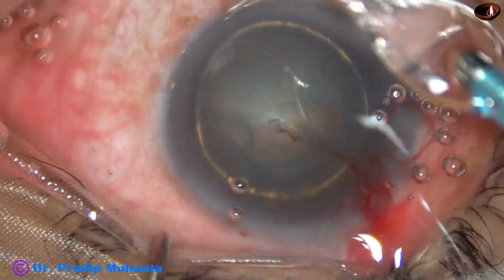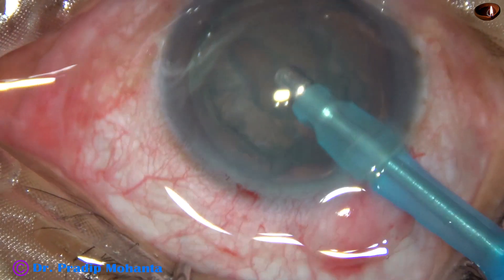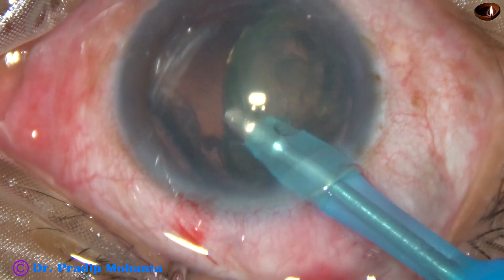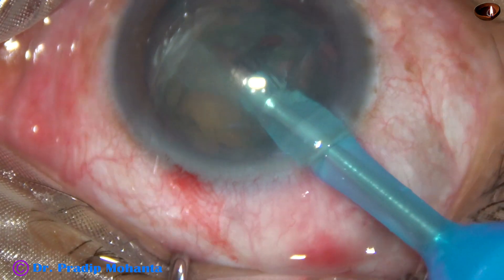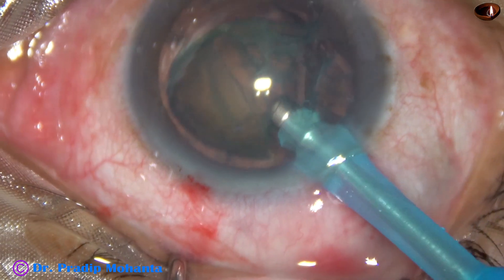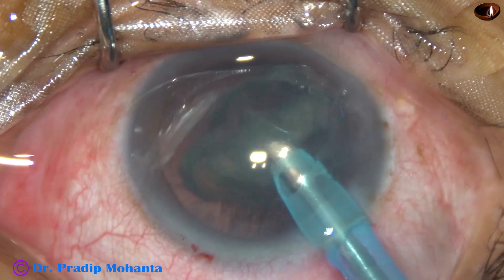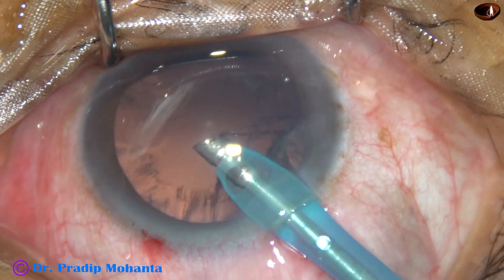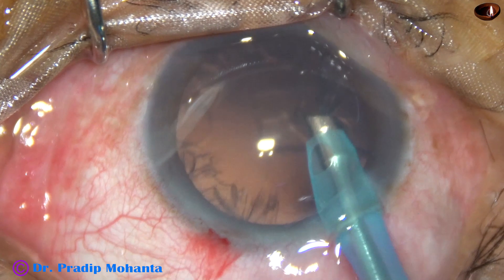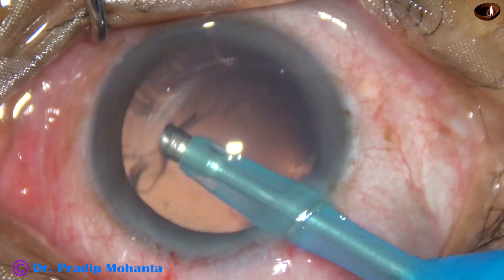Now let us see another case — the third case. I see the golden ring, which means hydro-delineation has been good in this case. Apply vacuum and a little bit of power. The lens tilts, and as it tilts, the portion just above the anterior capsular rim is eaten off. The tip is always at the iris plane, that is, the anterior capsular plane. When the lens mass tilts, tumbles, and comes to the tip, it is eaten off. A piece of epinucleus is just on the right side. Since there is no chopper, followability of the pieces is much more, and the surgery is quicker.